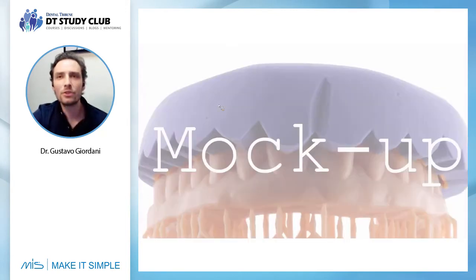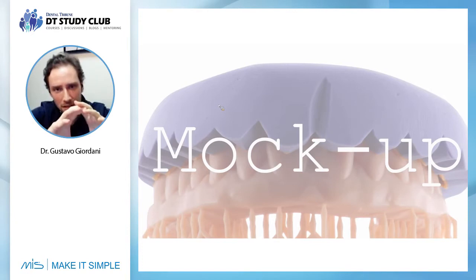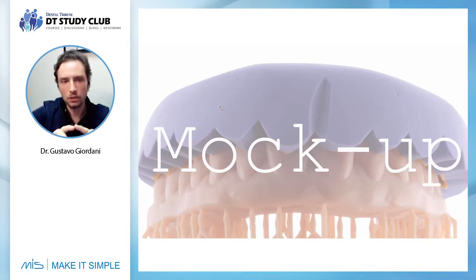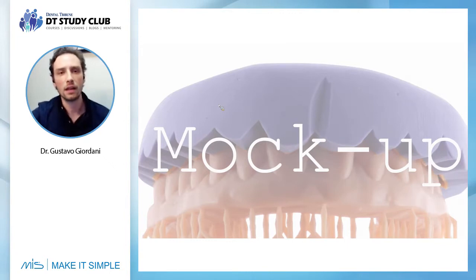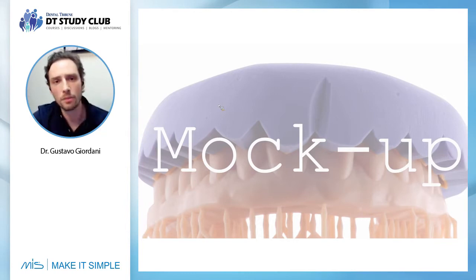So now it's time to select the shape for our patient, because the patient came to us for an aesthetic rehabilitation. So now I need to select the smile, I need to select the shapes, the tooth format, so I can plan the implant according to this rehabilitation, according to the final shapes. So now it's time to do a mock-up. Now it's time to test the new smile of my patient, and the patient needs to say yes to this new smile. Then I start to plan the implant position according to this new shape.